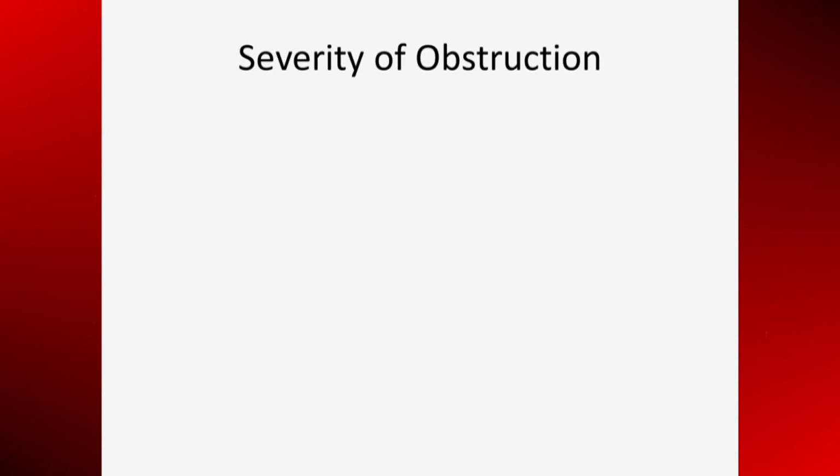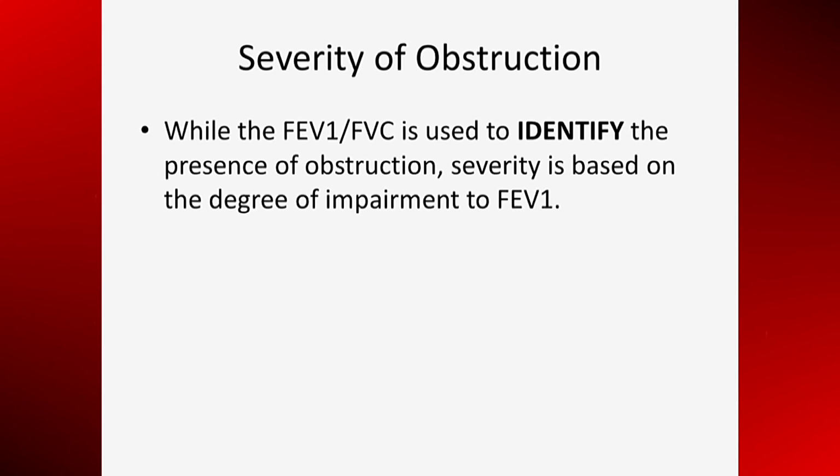There can be some confusion about the severity of obstruction. One cannot label the PFT as obstruction without seeing a reduced value for the FEV1 to FVC ratio. However, once obstruction has been identified, the severity of the impairment is best based on the percentage of predicted for FEV1.